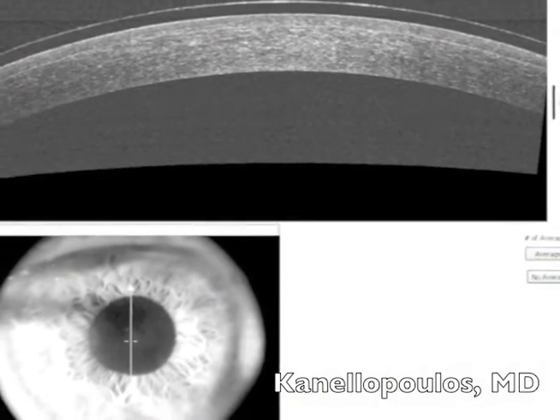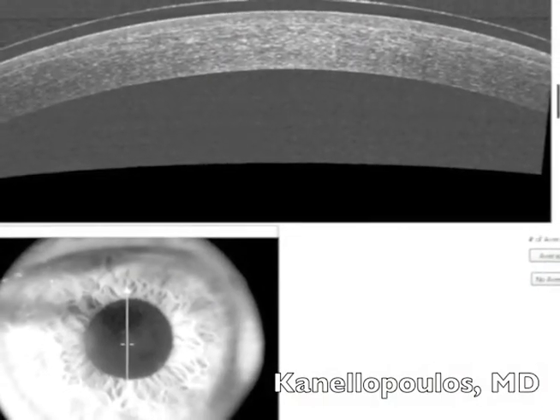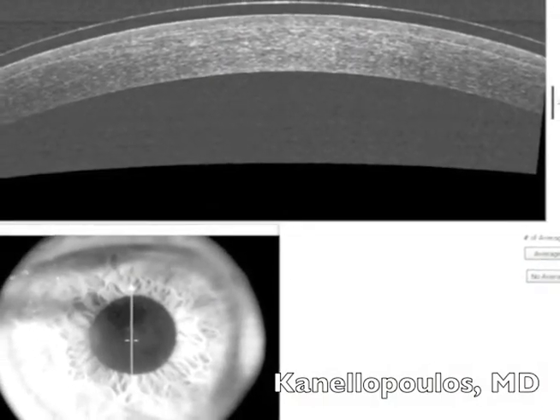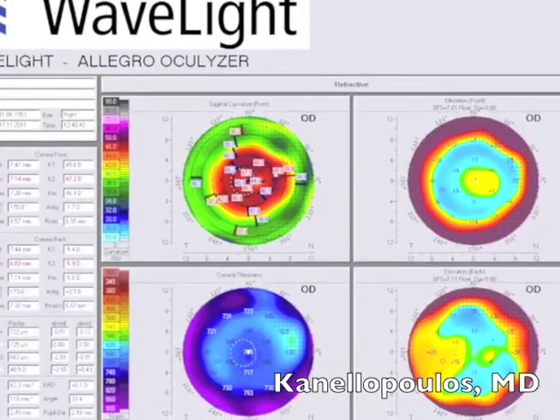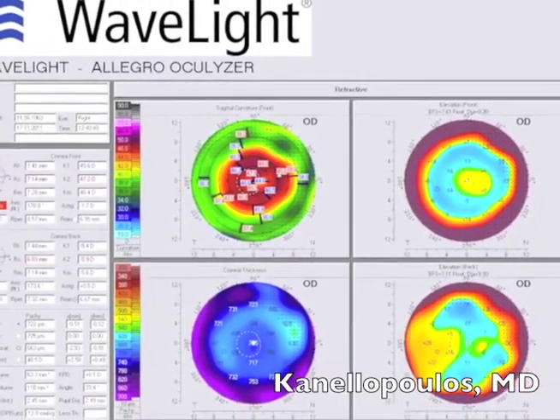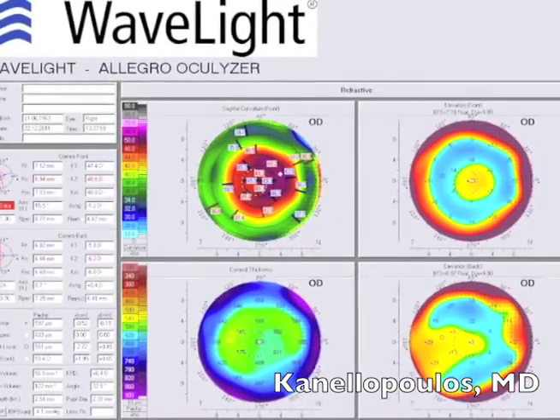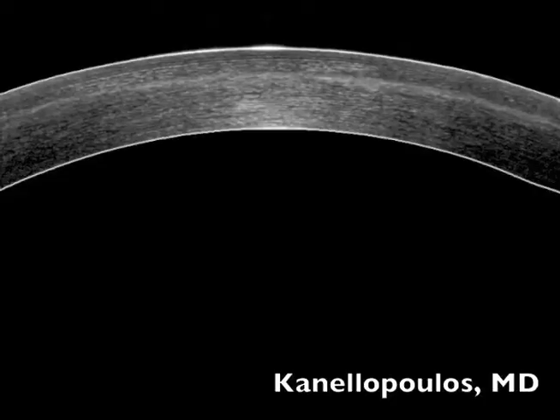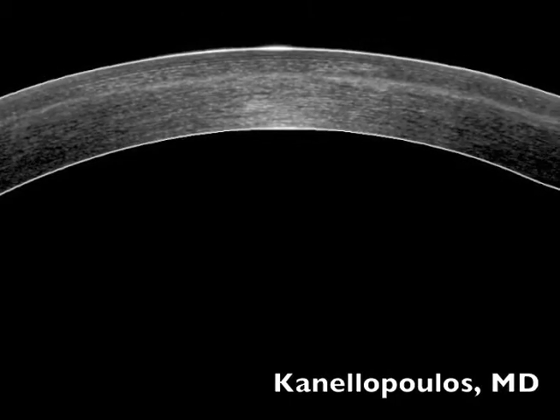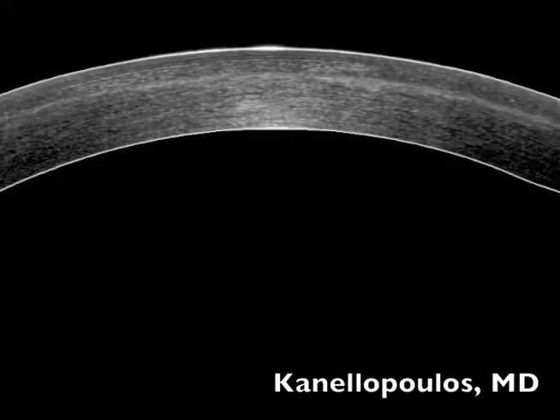This is the patient immediately the day after surgery — you can see the bandage lens and the hyper-reflective interface. At one week and one month postoperatively, there is a very stable refractive result of 20/20 uncorrected, despite the high correction. Here on OCT several months later you can see the hyper-reflective interface depicting cross-linking.